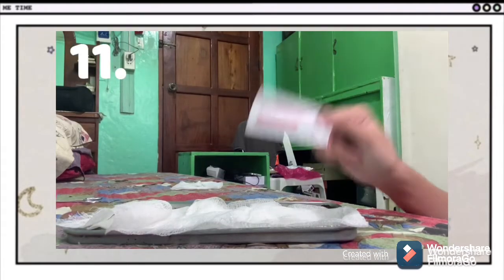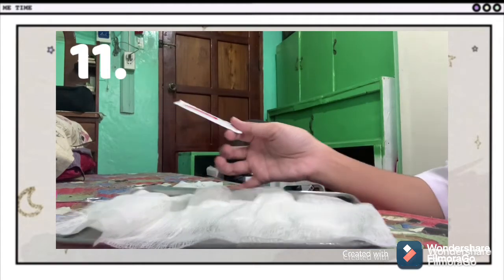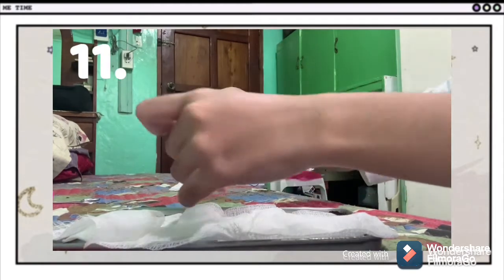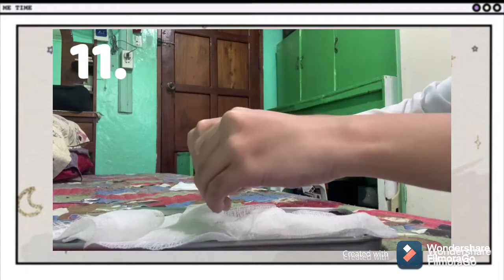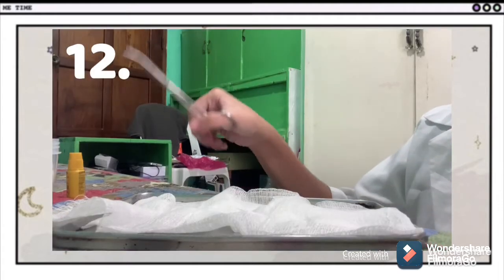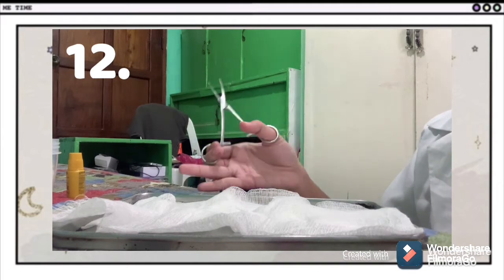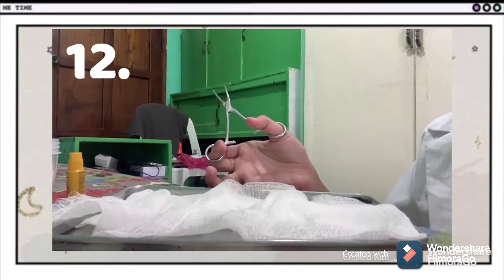Squeeze a small amount of lubricant over the sterile OS placed in a sterile field. Rationale: organization promotes efficient time management. Using sterile pickup forceps, get 2 cotton balls with betadine antiseptic solution from the sterile jar and place them on the sterile field on top of the several OS.